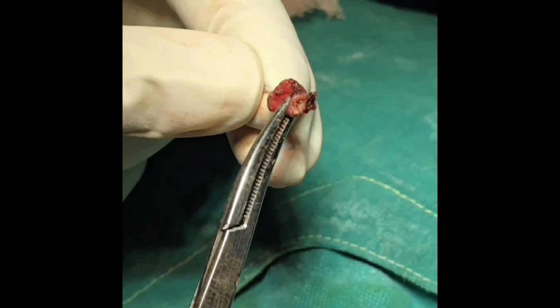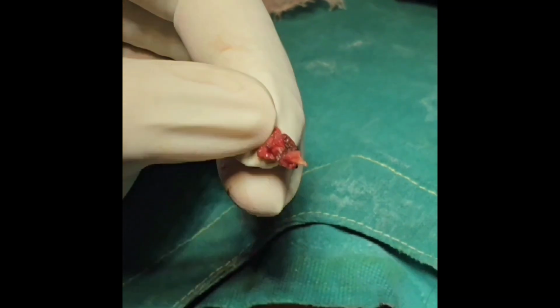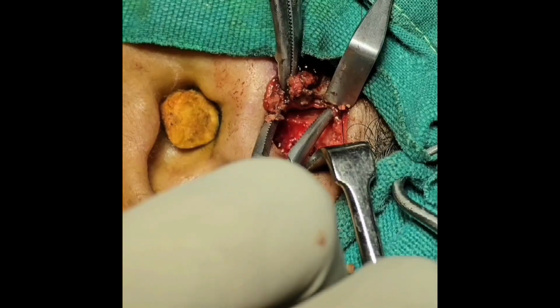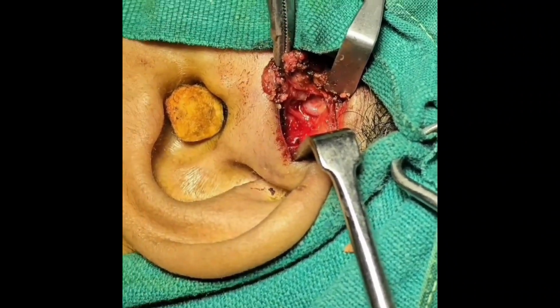And this is part of the tract with the cheesy material from within, and the other half of the tract is lying deep inside. This is the part which I had accidentally opened, and the residual part which I am holding in the forceps.